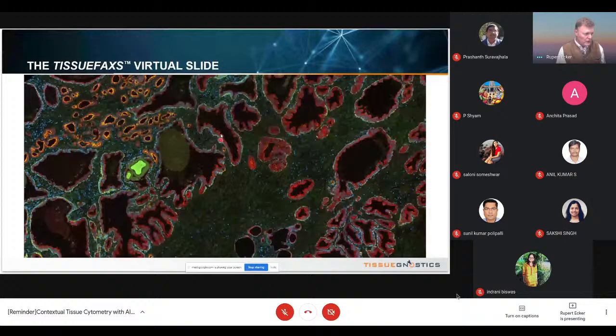Here is actually a prostatic stone or some sand. In red, we see a marker, cytokeratin. This labels the secretory epithelial cells. Here in green are the basal epithelial cells, and in orange is a kind of tumor marker which shows at an early stage malignant transformation. The absence of a basal cell layer and the presence of this marker on the secretory epithelial cells indicates on the functional level malignant transformation, and that this is actually a prostate cancer.